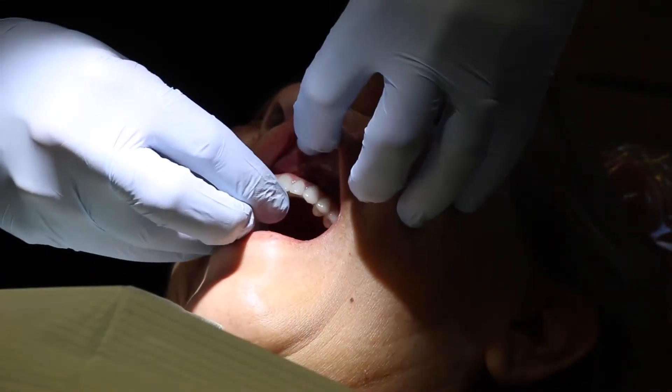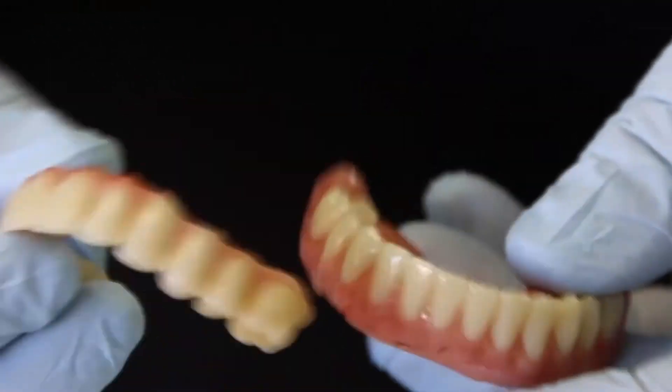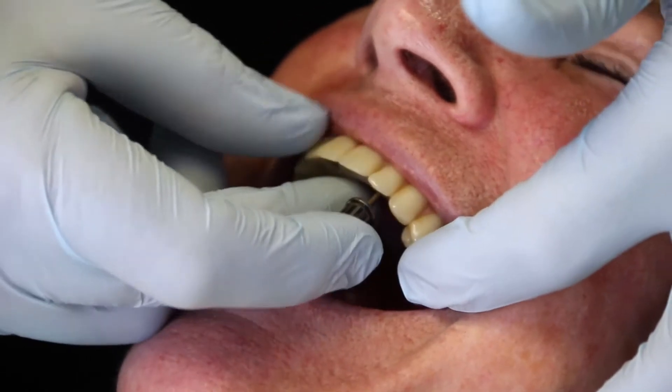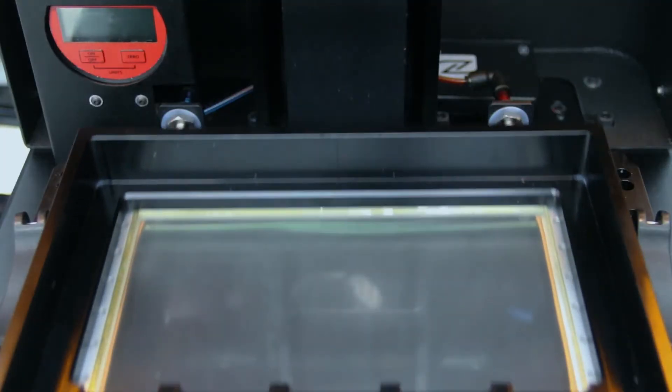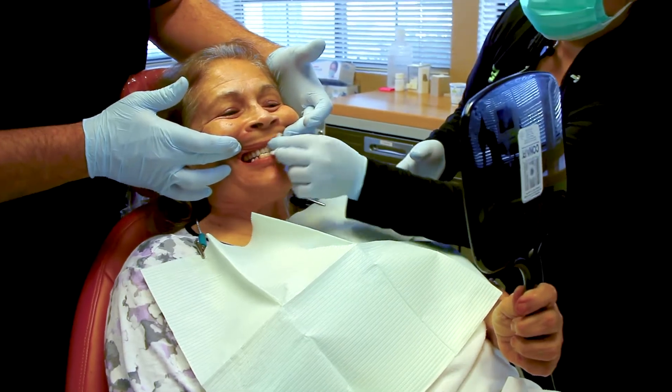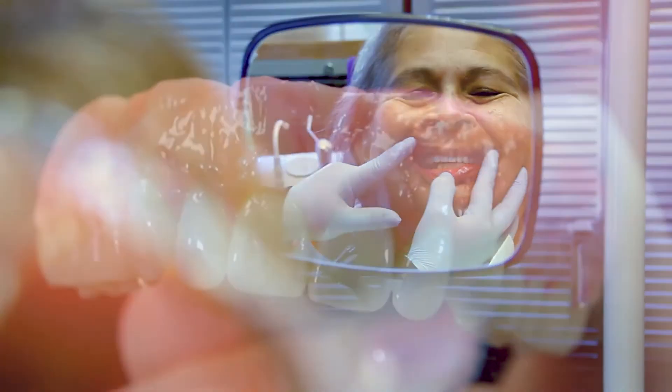And it's an amazing process, it's efficient. So when you run a busy practice you need things to work and work well. So it's very exciting to be starting my laboratory off with the best of technology. I'm excited to have the Envision One and be able to offer great 3D printed teeth to my patients.